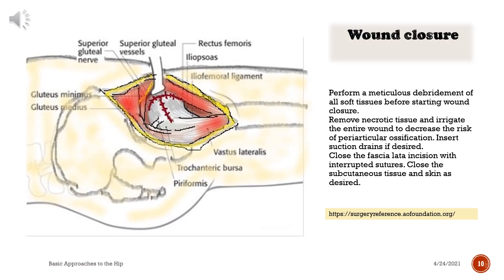Wound closure. Perform meticulous debridement of all soft tissues before starting wound closure. Remove necrotic tissue and irrigate the entire wound to decrease the risk of periarticular ossification. Insert suction drains if desired. Close the fascia lata incision with interrupted sutures. Close the subcutaneous tissue and skin as desired.